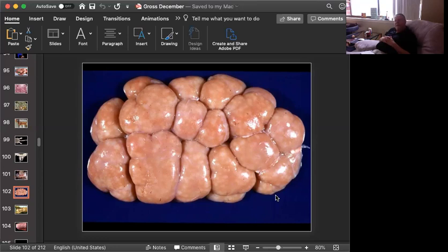Initially, these white spots are areas of necrosis with a little bit of neutrophils. Over time, they go through a maturation process, and most of the time, they end up as little bits of lymphocytic or lymphoplasmacytic inflammation before they resolve. The morphologic diagnosis for this would be a chronic suppurative embolic nephritis. Embolic because it comes through the bloodstream. It explains the multifocal, somewhat miliary nature of these white spots. So chronic suppurative embolic nephritis.